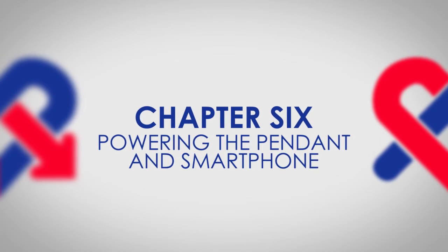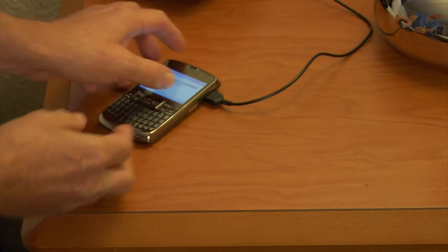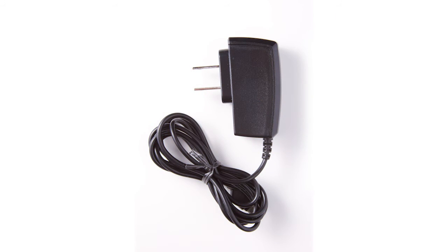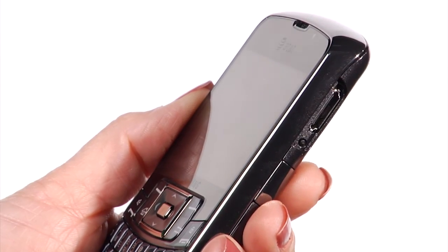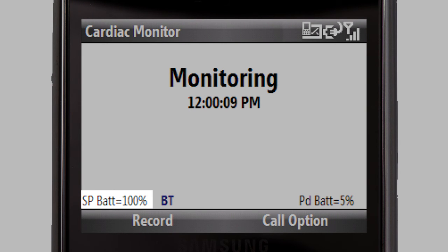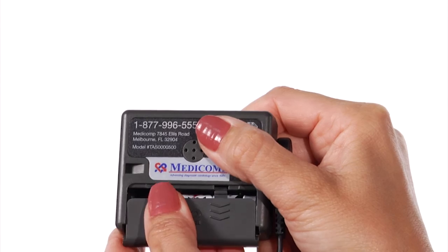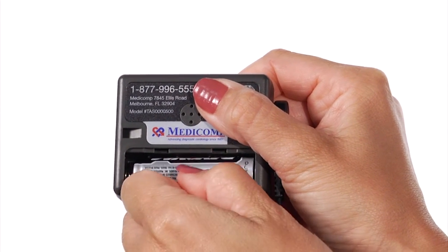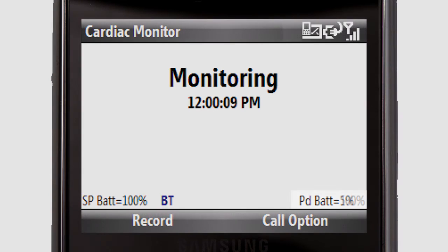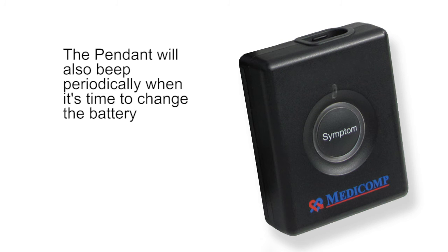Powering the pendant and smartphone. Charging the smartphone: Be sure to charge the smartphone daily. Charging the smartphone overnight should ensure enough battery power to last an entire day. The charger can be found in your kit. Connect one end to the smartphone and the other to a wall power outlet. You will see a battery indicator on the screen. Once the smartphone is fully charged, disconnect the cable. Pendant battery: The pendant uses one AA alkaline battery that needs to be replaced periodically. The smartphone will alert you when the pendant's battery needs to be changed, and the pendant will also beep periodically when it's time to change the battery.